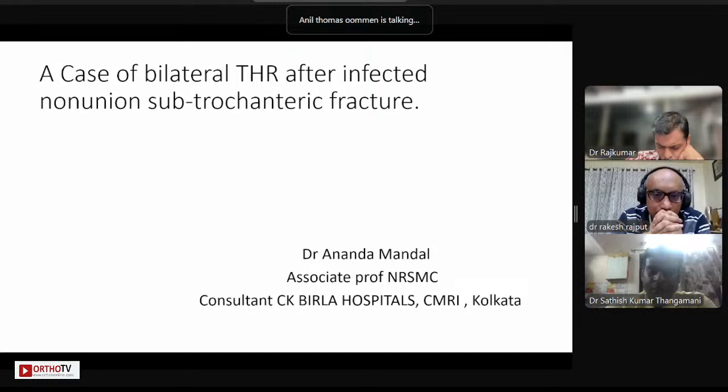And as Raj rightly said, Wagner is another stem which is more distally loading, and it's a cheaper option. So if you could pool your resources only for the implants, and that's what we often do, that would be a good thing to do. But having said that, bone graft in cage is a very good option that you've done. So there's no taking away from the fact that this is a job well done. But if given a choice, and if you have to titrate your resources, this would be the best bet.